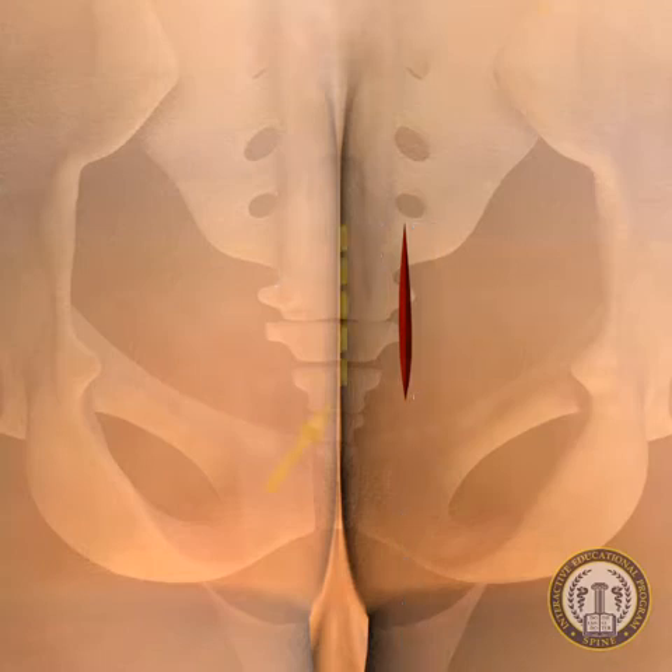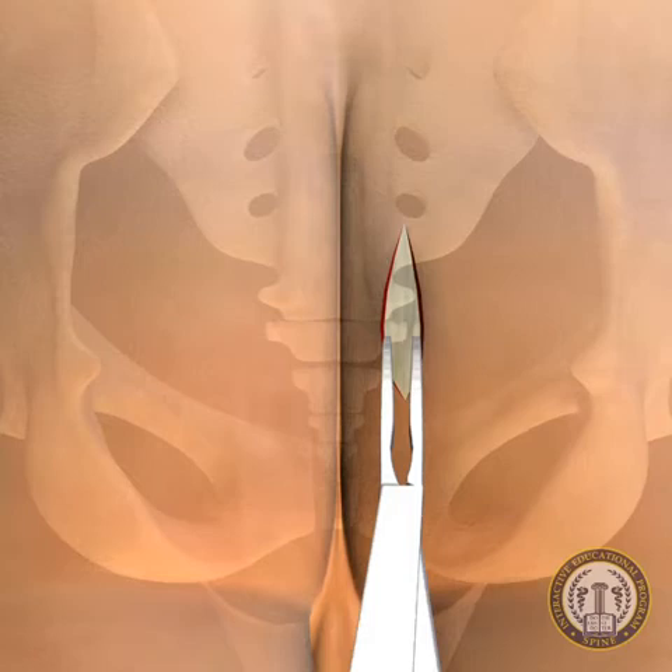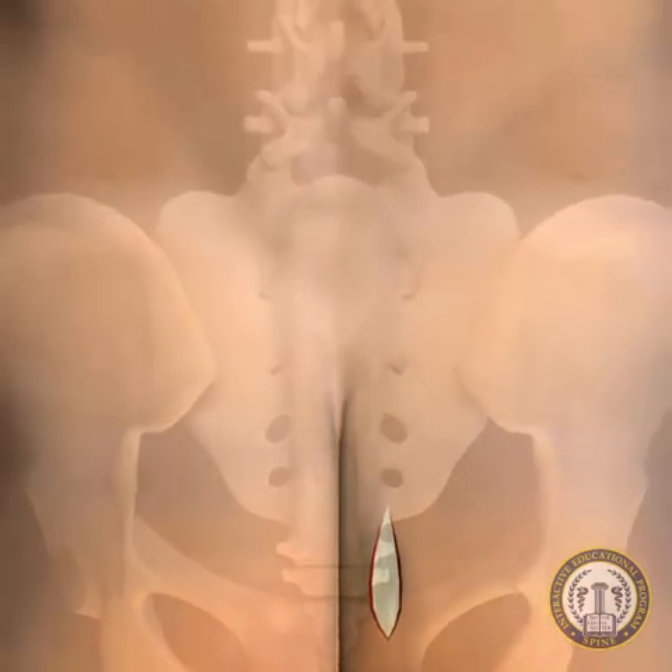Alternatively, a midline incision may be used. Blunt dissection is then carried to the parietal fascia. This may be done with the tip of the index finger or a blunt clamp such as an 8-inch curved kelly. The general direction is the midline and anterior border of the sacrum.